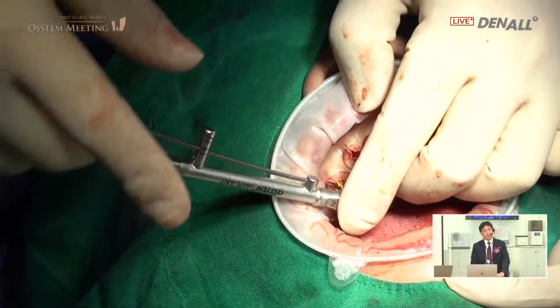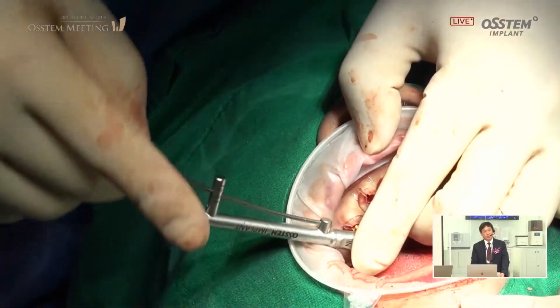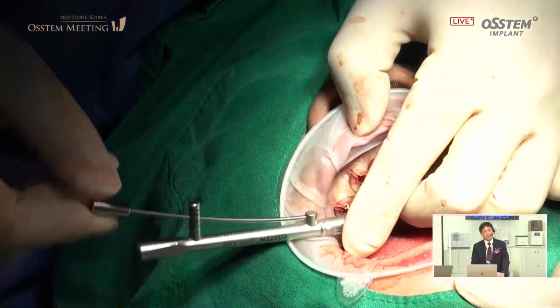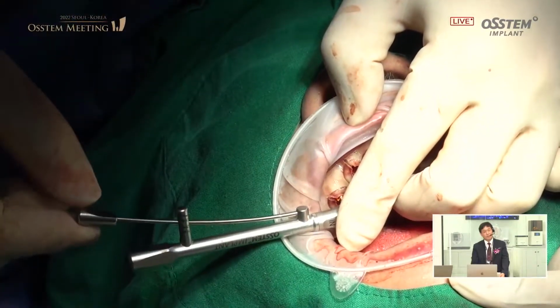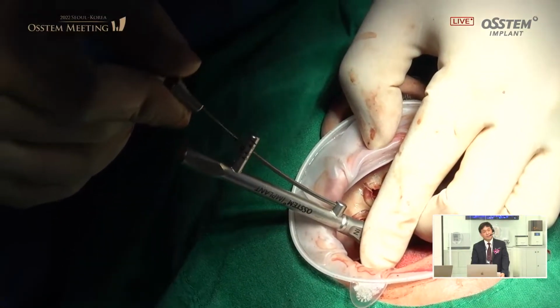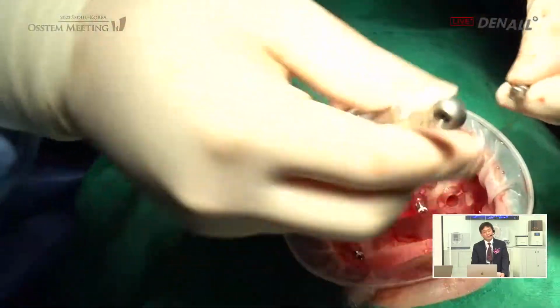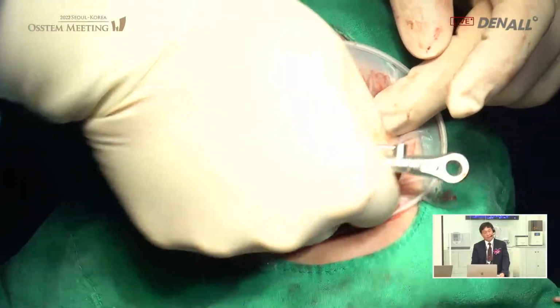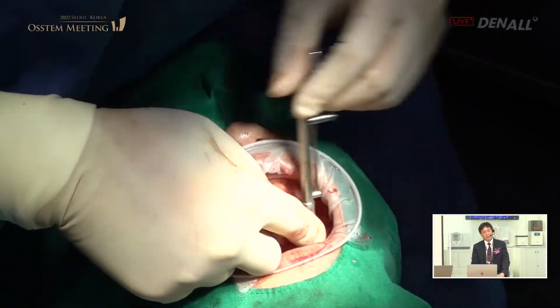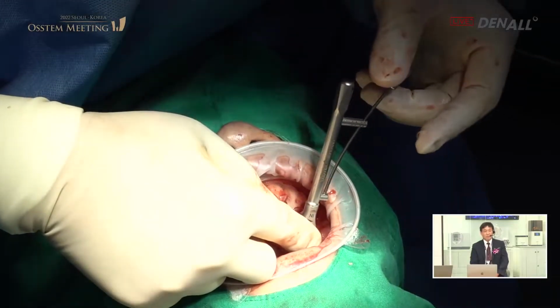Number 15, posterior area. I think that's the issue. I think it's about 10 Newton. About 20. In actual clinical practice, I don't prefer immediate loading because in the upper, even if you place a 6 implant, if you can't get the 30 Newton in one area, failure can occur.